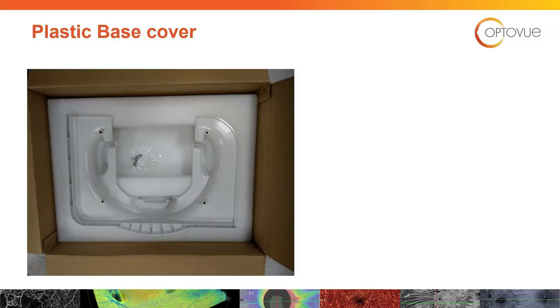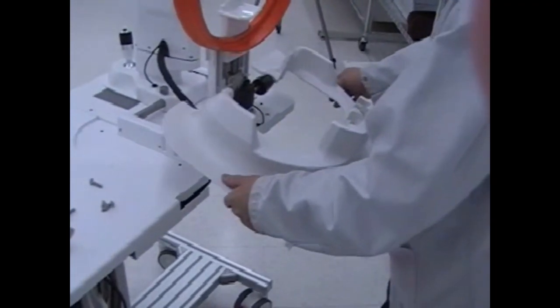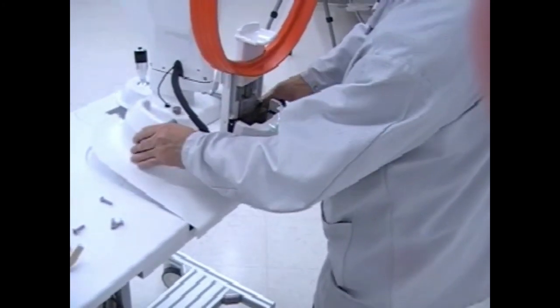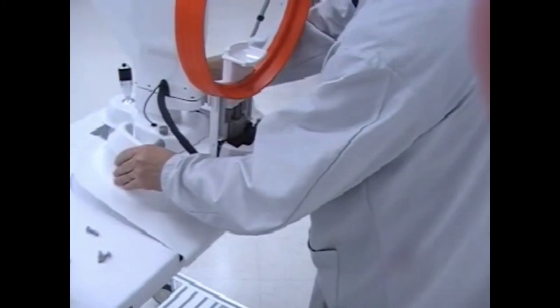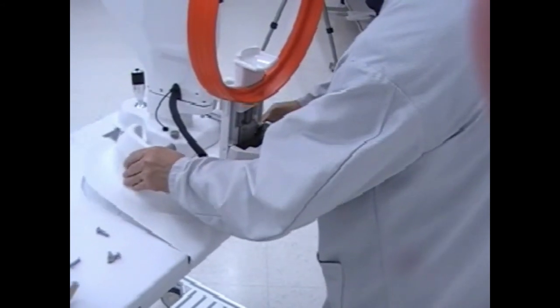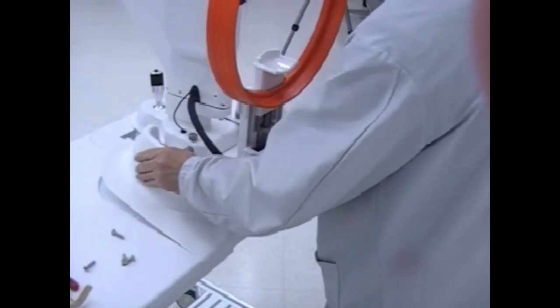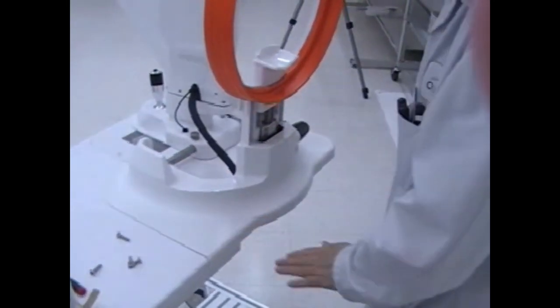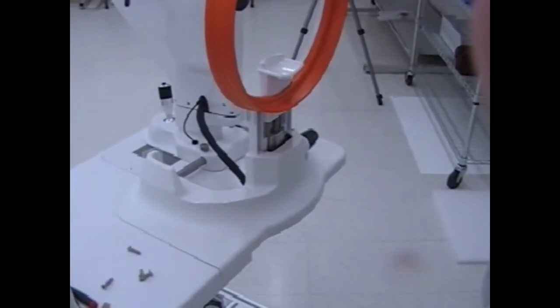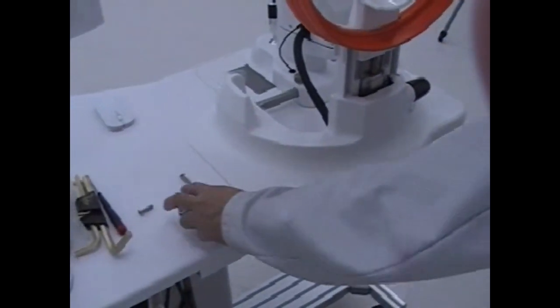Having removed any protective film covering, apply the joystick cover. Take care around the adjustment knob. Slide it into the groove, then push forward. Wiggle it a little and allow it to snap into place. Do not apply a lot of pressure to force it. There are four screws located under the table to lock it down.